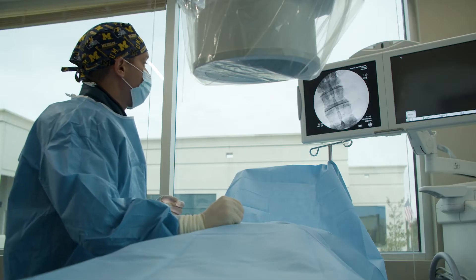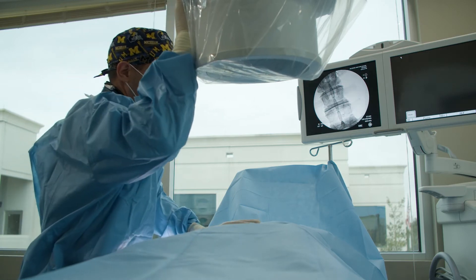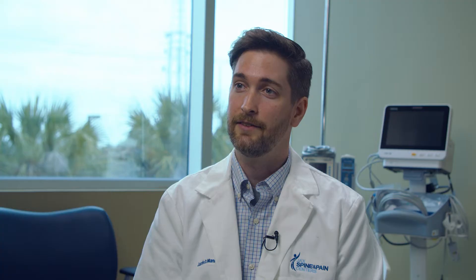Patients are given gentle sedation for the procedure through an IV. It's something similar to what you'd get if you were having a colonoscopy. They're positioned on the examination table on their stomach, which can sometimes be difficult for patients if they have a lot of pain, but thankfully they have an IV and can receive pain medications, and it makes the procedure more tolerable for them.